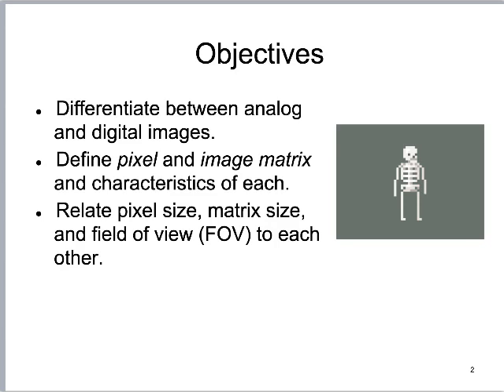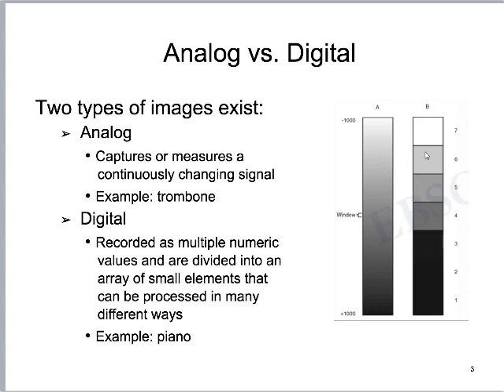Sometimes when we talk about contrast resolution, we might refer to it also as low contrast resolution. Those terms are interchangeable. I don't want you to get tripped up by that if you see it somewhere else, in another textbook or what have you. It is used frequently in writing about CT, that CT has a high specificity for low contrast resolution, meaning it has a good contrast resolution. Mr. Roberts? Yes. You said low contrast resolution is also what? Low contrast resolution, we could just call contrast resolution.